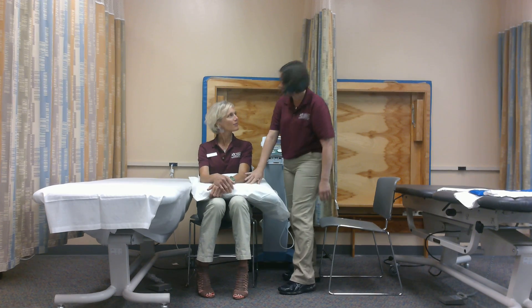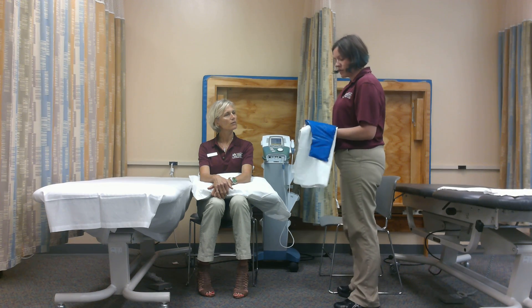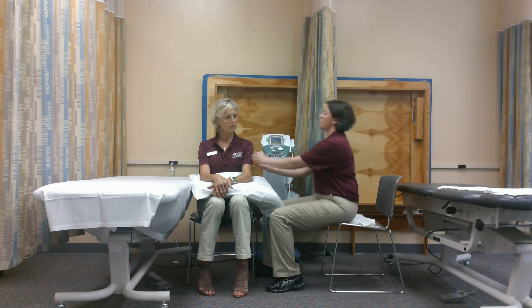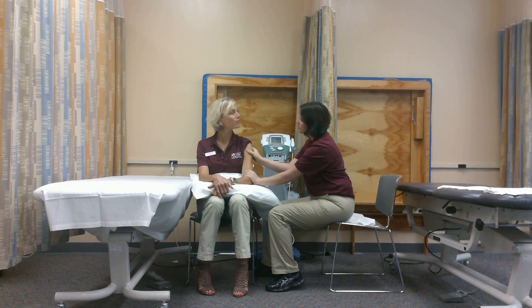I'm going to put this here for comfort. I have an ice pack here and we're going to use one barrier because I don't want the ice to be too close to her skin. The first thing I'm going to do is assess her shoulder and make sure that everything looks okay and that she has good sensation. You feel this? Good.